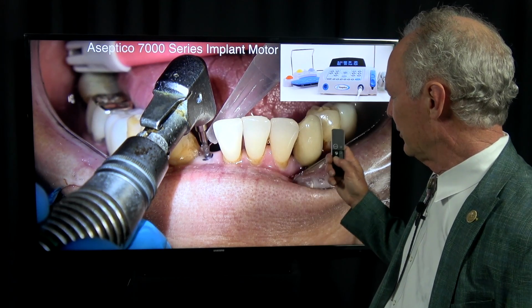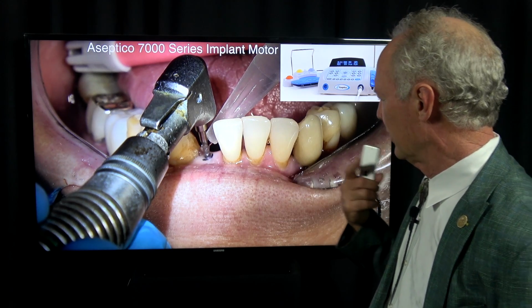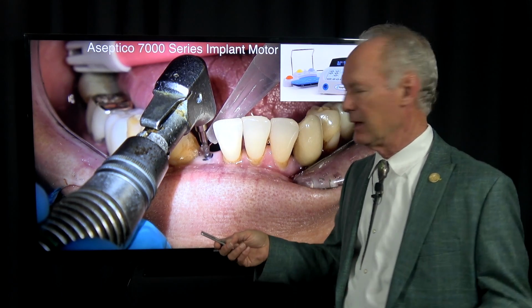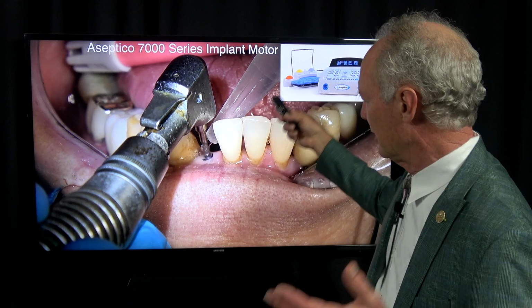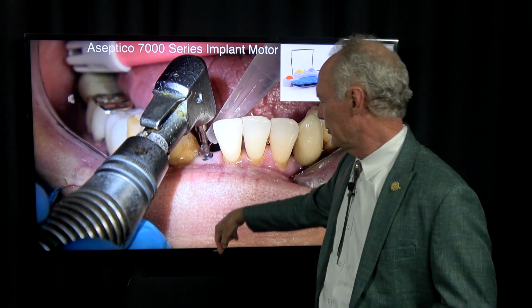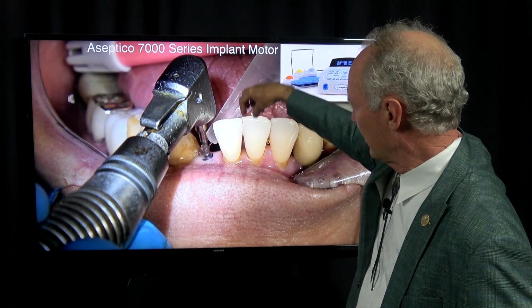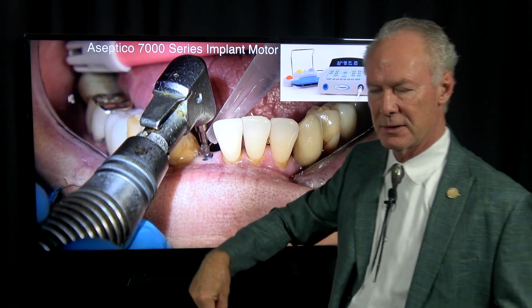Now, I'm not worried about drilling to a certain depth in the lower anterior, because you've got plenty of bone. If you drill a little bit past the depth, I think that's not bad. Now, I'm drilling to depth in this case. Remember, with small diameter implants, you don't have to drill to depth, because they bite and they seat themselves. They pull themselves into the osteotomy site or into the bone, just like a wood screw. The reason I'm drilling to depth is that if you just drill through the cortical bone and then start advancing the small diameter implant, it may go off to one side or the other.